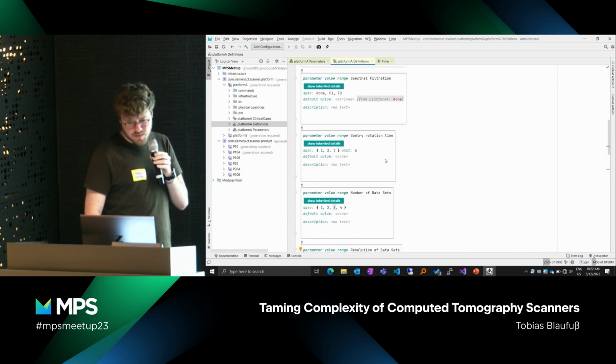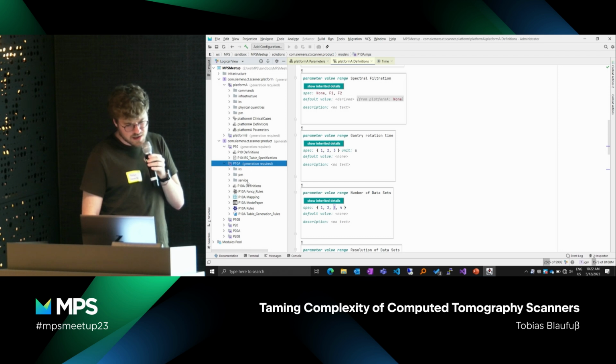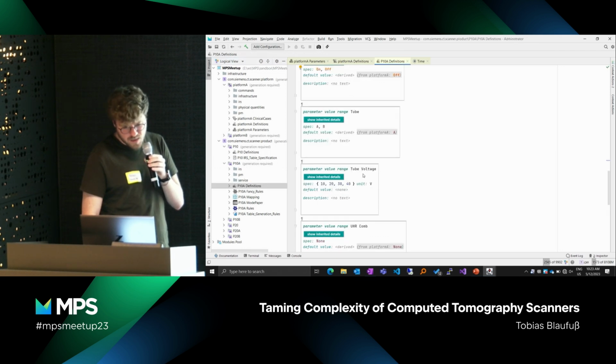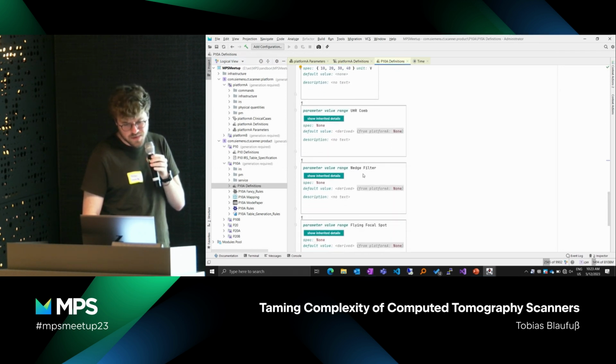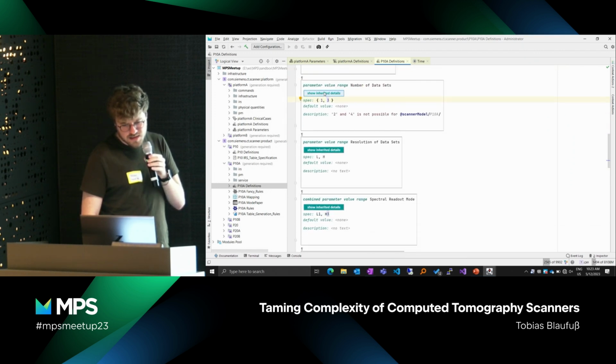And as said, you can restrict these ones. Here we are at the highest hierarchy, so there is nothing to restrict here. But as we continue downwards in our hierarchy, we see, for example, in the bottom one, that we restricted some parameters here.